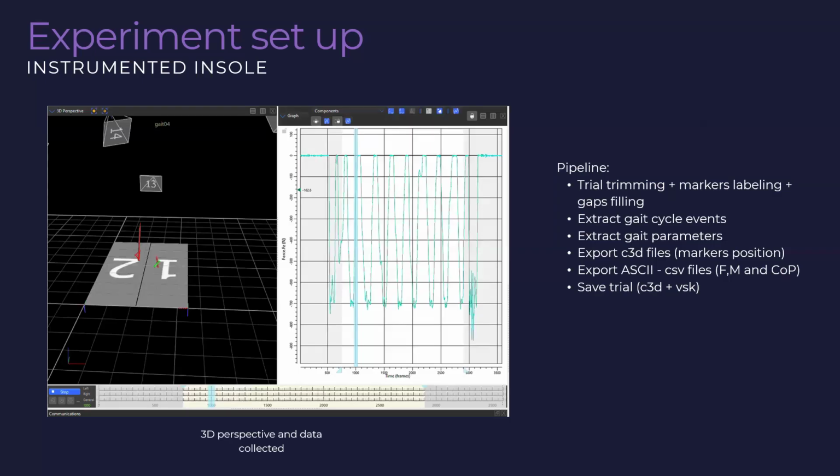How about the session? It depends. For example, with Olivier, we had to adjust the threshold for my gait parameters extraction for the install because the values were a bit higher. Usually the trial itself is between 20 and 30 minutes. But before that we have to do the calibration of the system and prepare the subject. It's longer to get there than the trial itself.